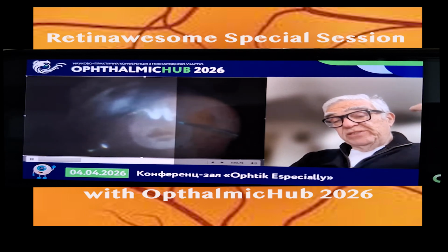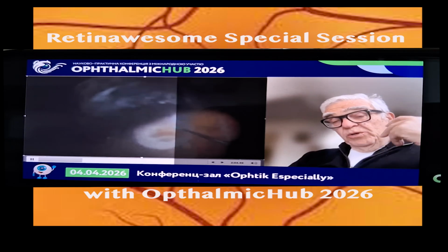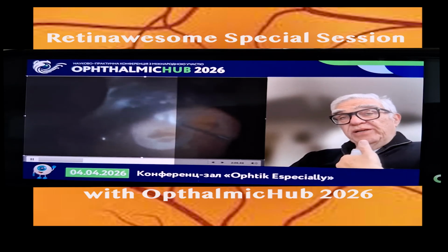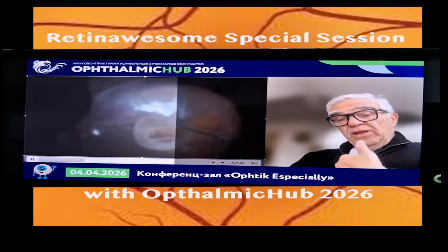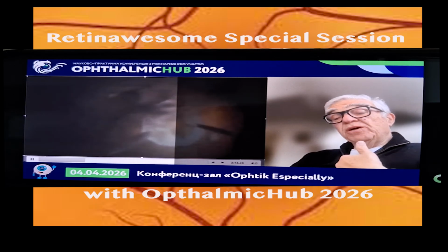And we should not reattach the retina. We should not inject perfluorocarbon liquid to flatten the retina because the nucleus is going to go behind there. And we have to remove the nucleus. And we did it with phaco.